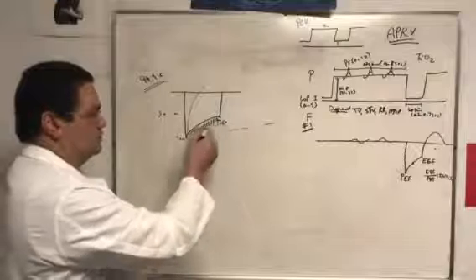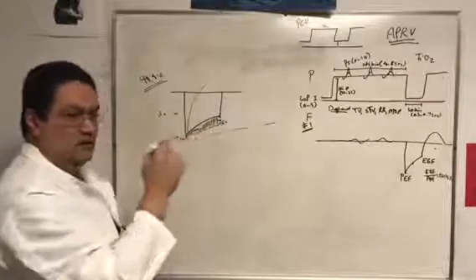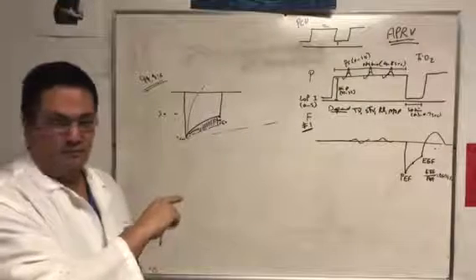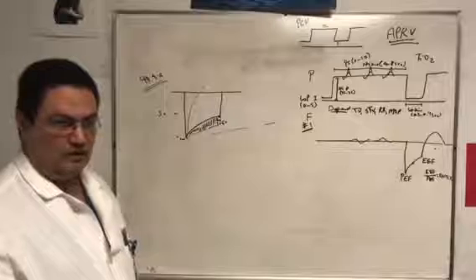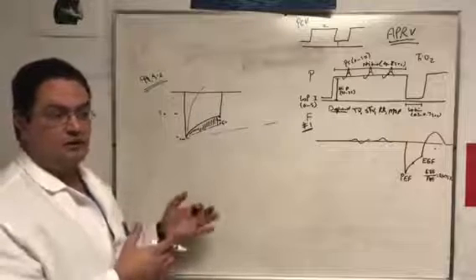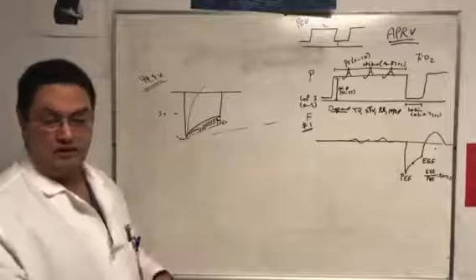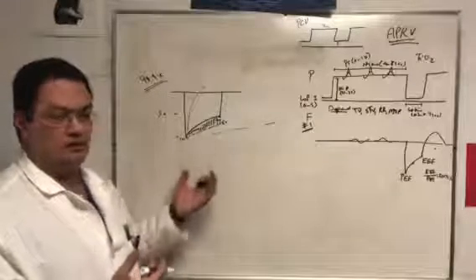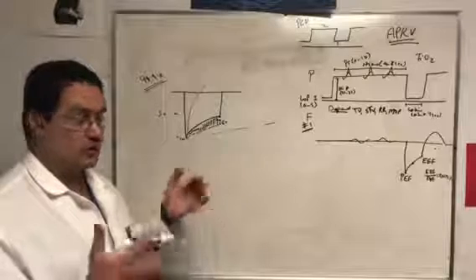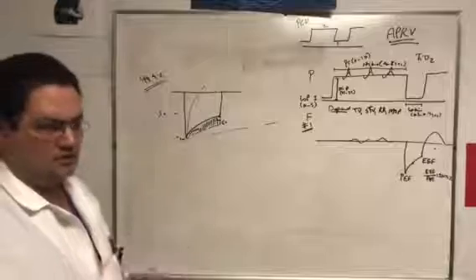So if this is a new waveform, that means that there's an additional area under the curve, and that means that the patient improved, right? Recruited, and that happens 99% of the time, and almost guaranteed. I almost guarantee you that this will happen. This mode has so much pressure in it that will guarantee you. This is another claim to fame to this mode. It will recruit. It is guaranteed recruitment for the patient, except in rare circumstances. Okay.